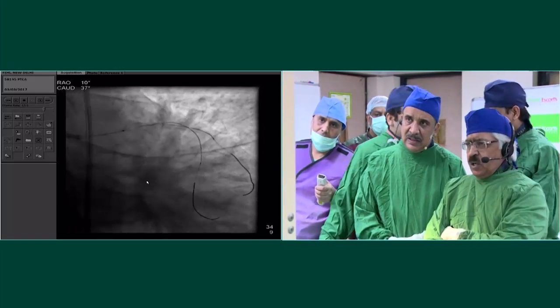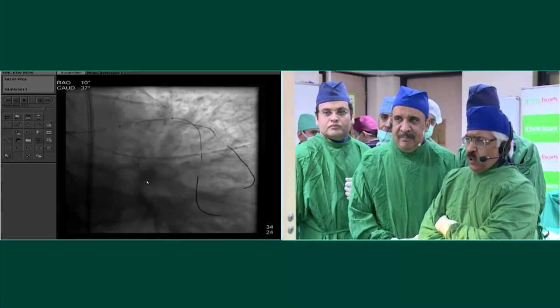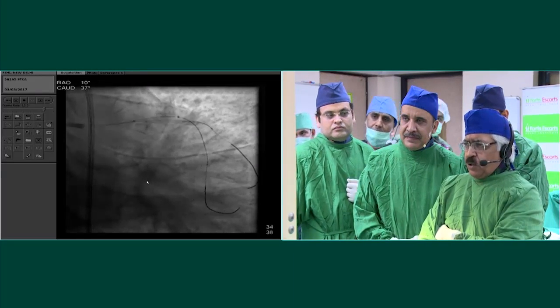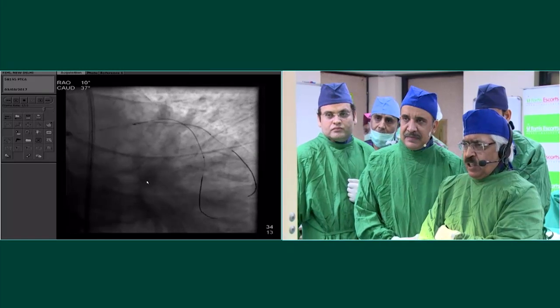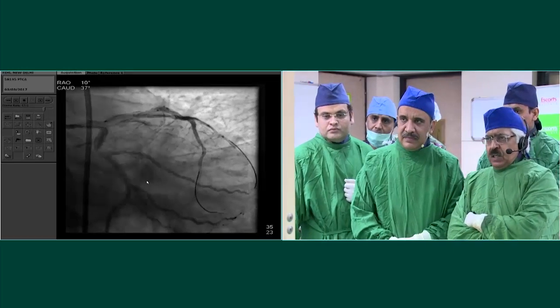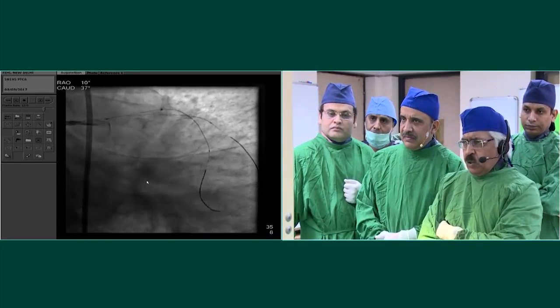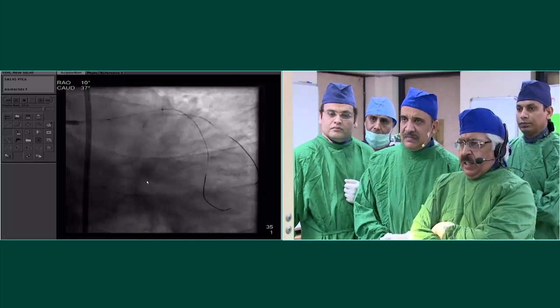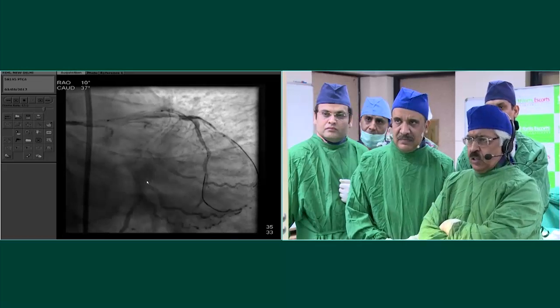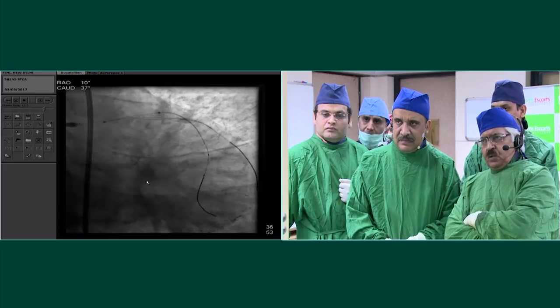Next. And as you remember, we had the ostial dissection as well, and therefore it was very important to catch the ostia, but the ability to catch the ostia versus not protrude too much was the biggest challenge. Next. And this is what I'm trying to do here. And remember, there's also this disease process there, and all those issues in mind. And therefore I did position it, but I think I came slightly proximal, but not so bad. So you'll see the next one. This is where it's going up. Next.